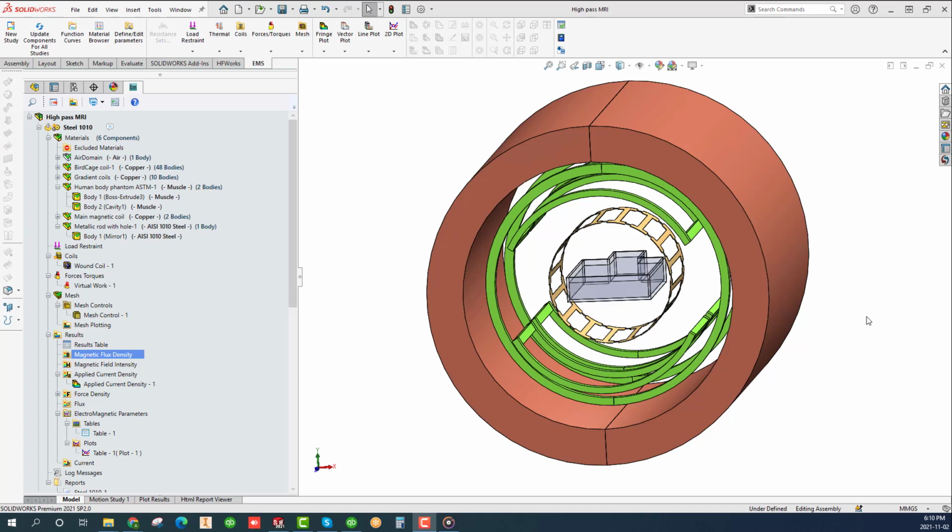In this webinar, we shall explain to you why the technician insists on not having any metal whatsoever, not even a gold ring. Unlike the technician who instructed you without giving you convincing reasons, we shall use low and high frequency electromagnetic simulation to explain the technical reasons that satisfy your critical engineering minds.